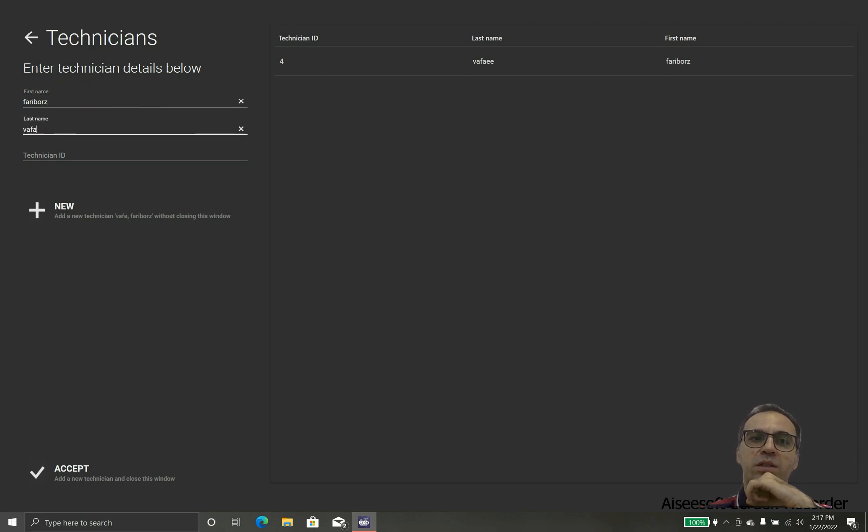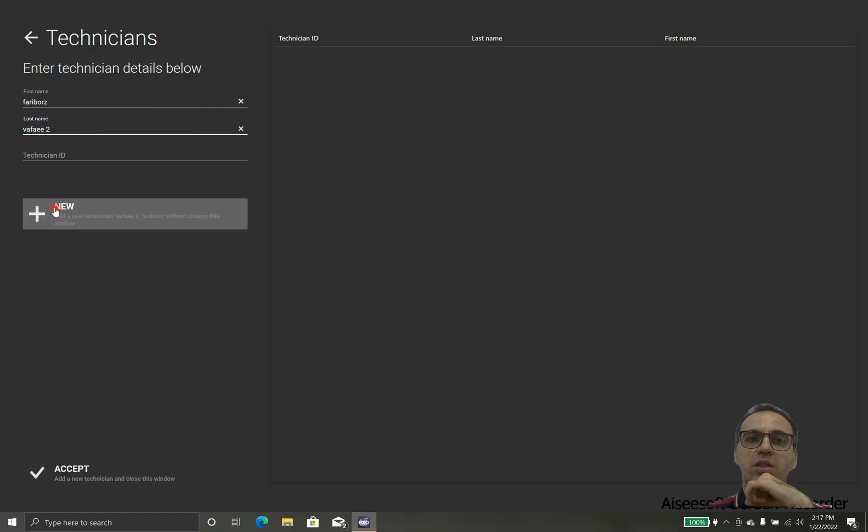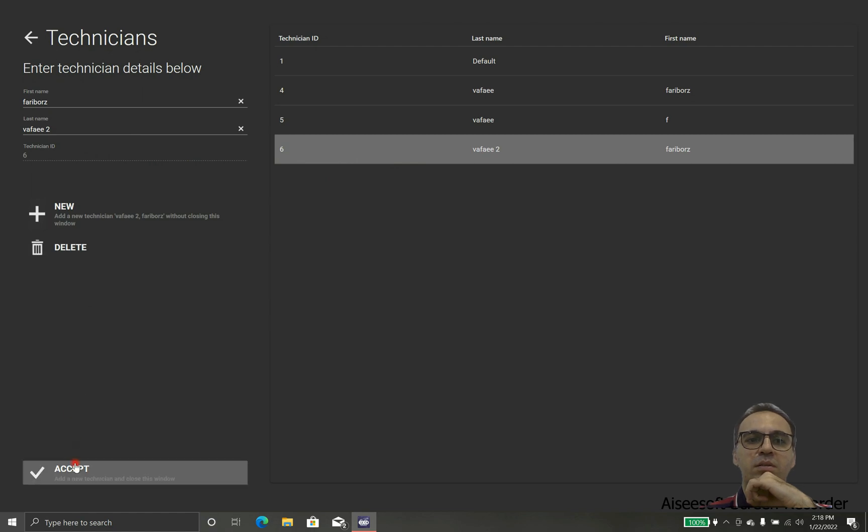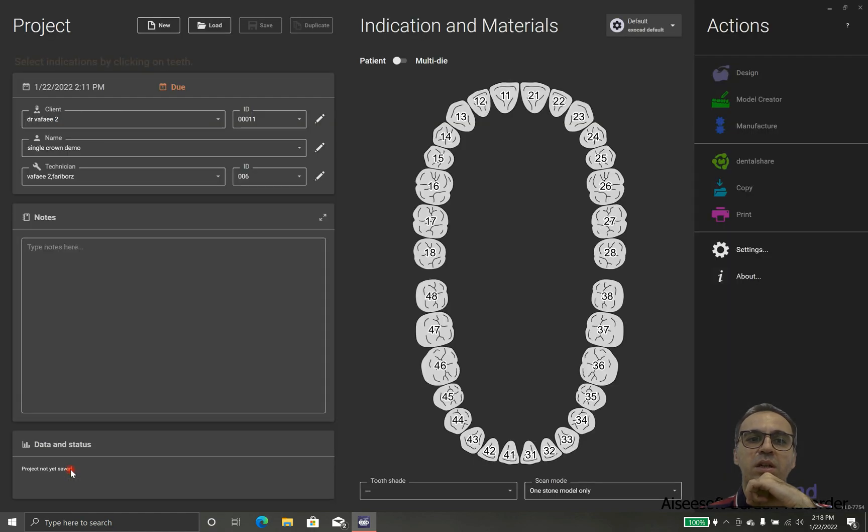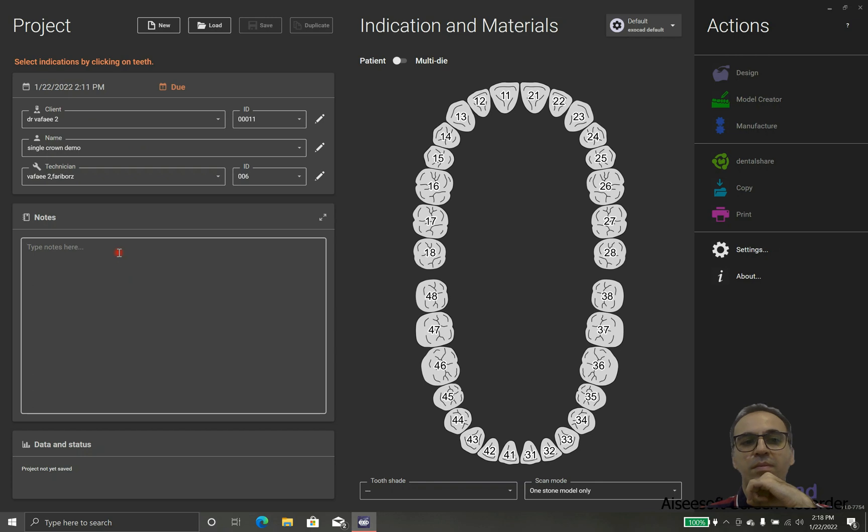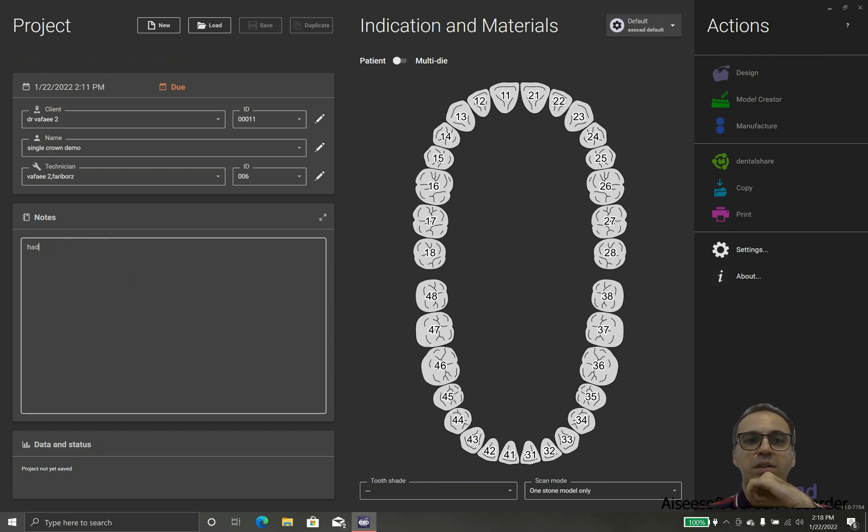The technician: in case that more than one person is using the ExoCAD you can change the technician so everybody knows which file is designed by whom. Because in this case I'm going to design, I will insert my name and it adds technician number six.